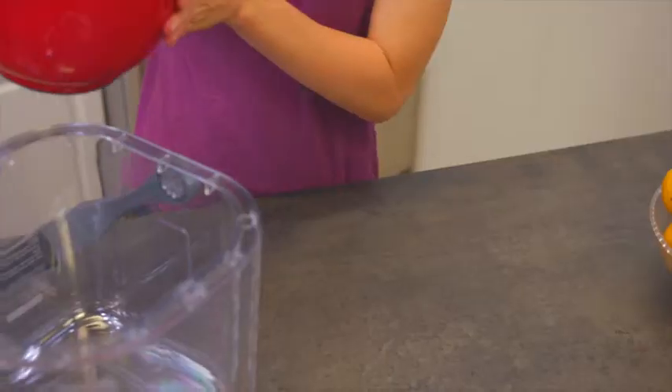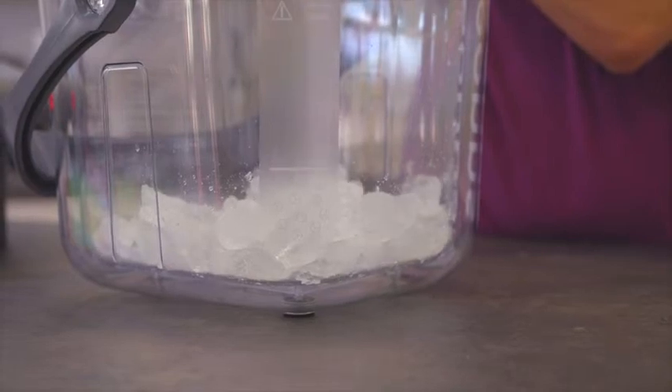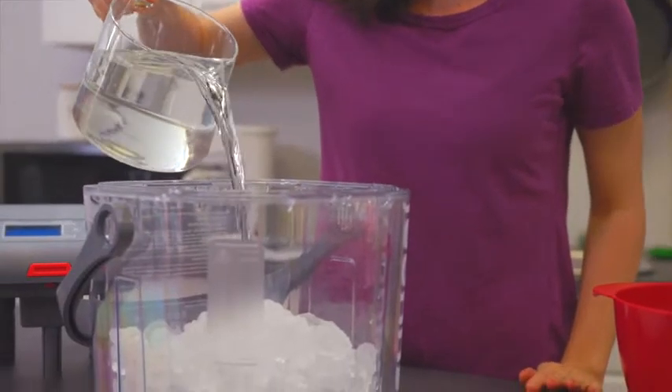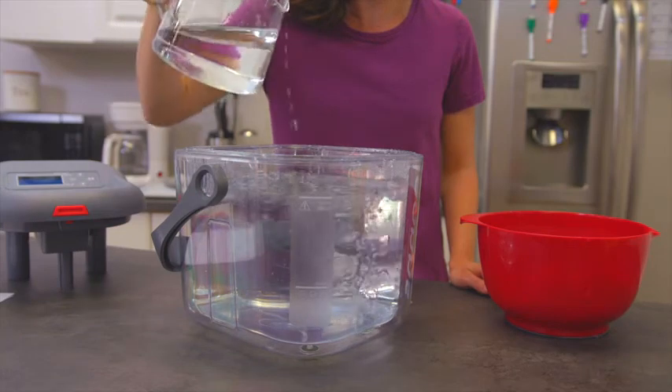To begin, fill the reservoir with ice up to the ice fill line. Then add cold water to the reservoir to the water fill line. Do not fill past the water fill line.